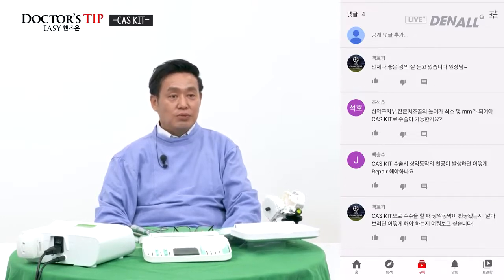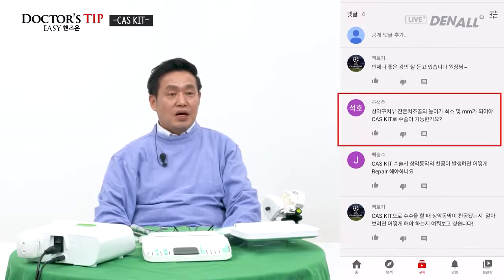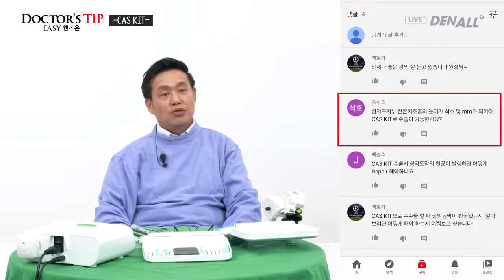The next question. What is the minimum height of residual bone in the upper posterior to do surgery with a CAS kit? In the past, we determined the lateral versus crestal approach depending upon the height of the residual bone of 5 millimeters. If the residual bone is higher than 5 millimeters, crestal approach. If it is lower than that, lateral approach.